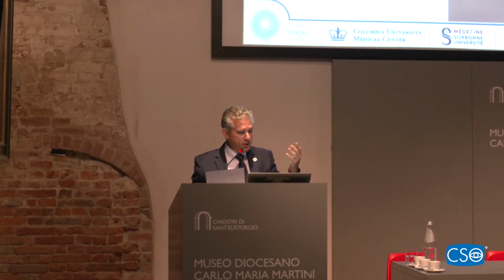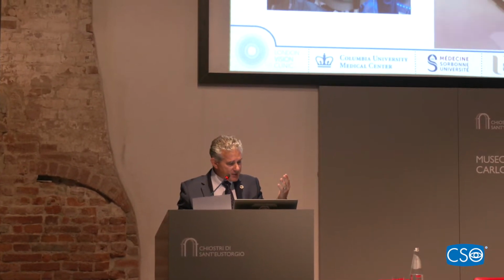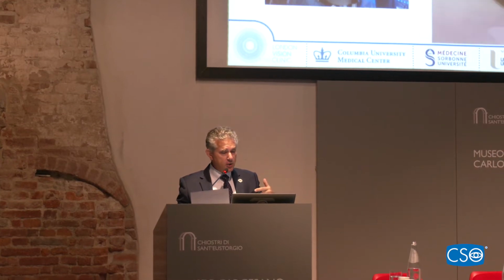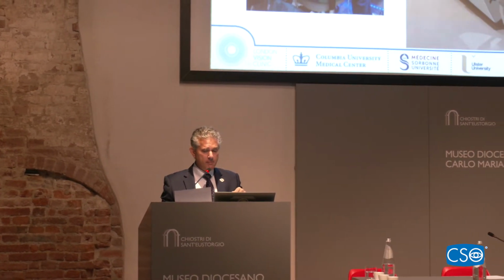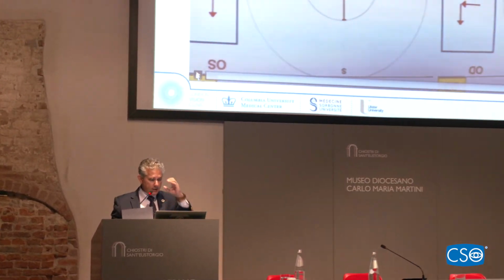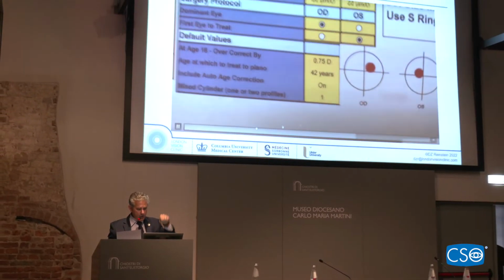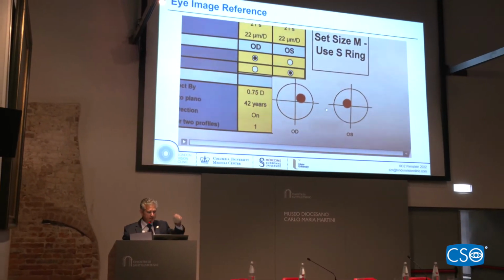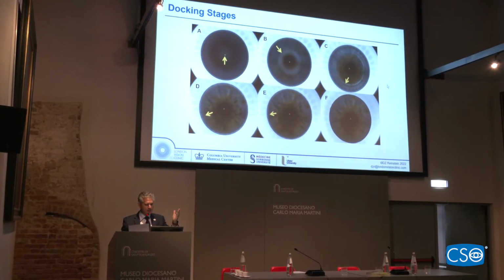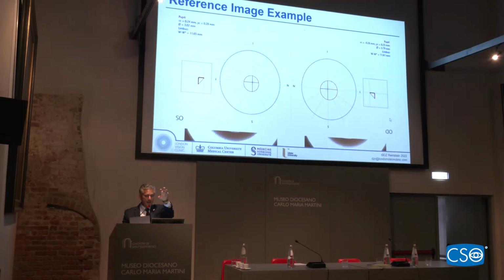I'm just showing you here my friends in Peru who are following the exact standard operating procedure. I asked Francesco if he would be able to program this, and he did. So when I do suction, and then I look at this, and then I look at the Hirschberg reflex that I had pre-op, and obviously I have my docking stages of smile, I have this image in front of me, and I can compare them.